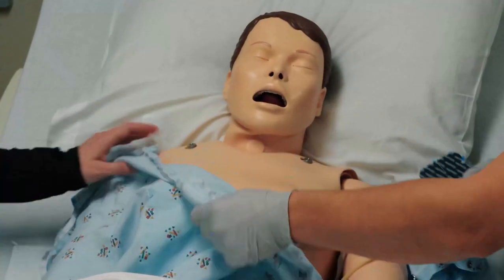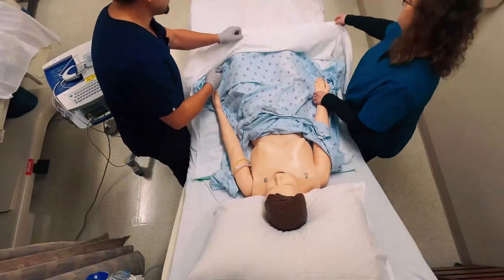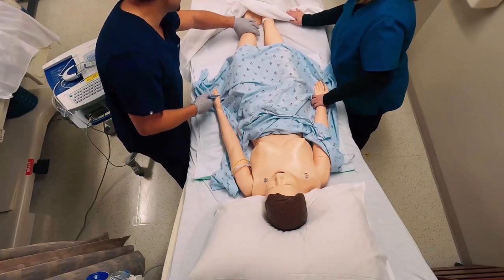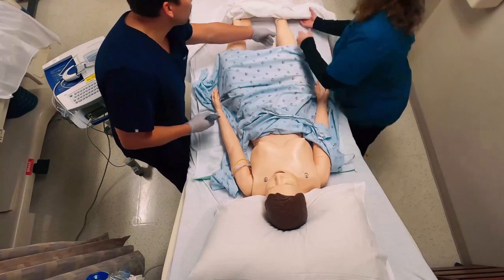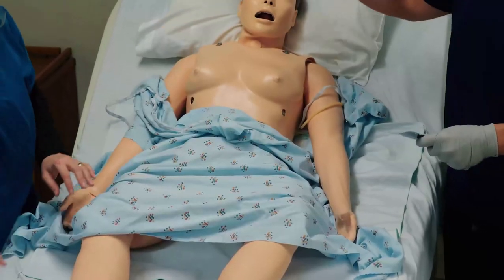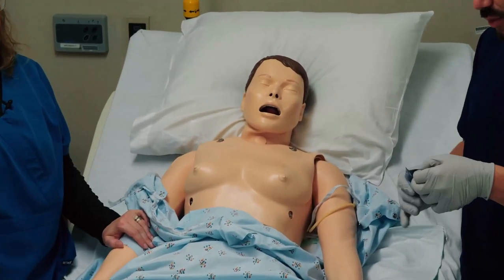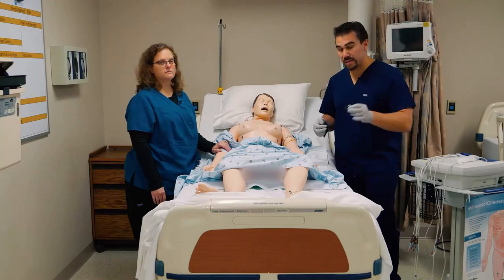We're going to visualize the chest and the extremities as well. On a 12-lead, it's called a 12-lead not because there are actually 12 leads, but because we have 12 views of the heart. We're basically going to wrap the heart with these little stickies to visualize it.